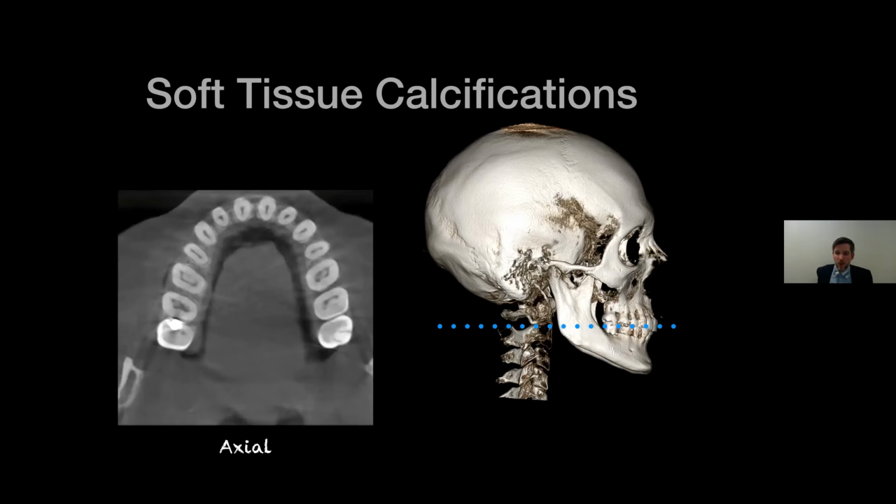There will always need to be a human signing off on a particular impression or diagnosis. So there will always be the human component. But I do think AI will be an option for a really good diagnostic tool in the future. So I'm all about not fighting that wave that's coming. I think it should be embraced. But again, I think there will always be that human component.